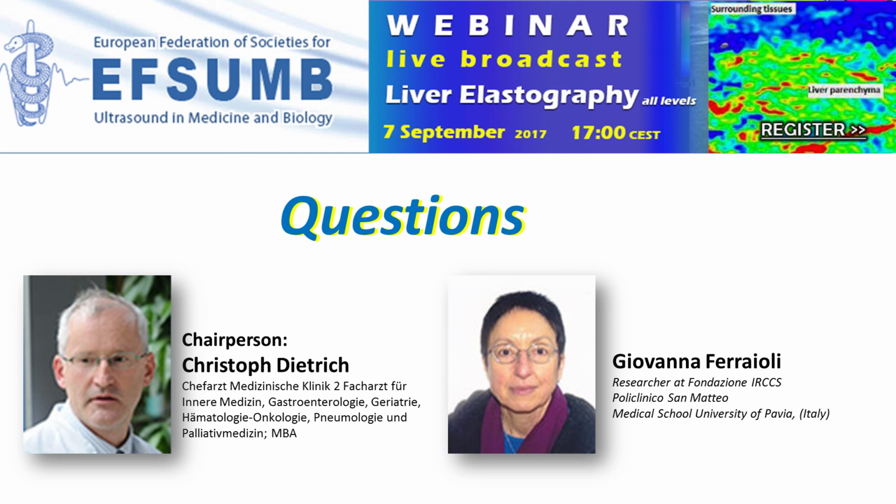The accuracy in assessing portal hypertension has been assessed comparing the results to a gold standard, that is the measurement of the pressure in the portal system. So the method is, from the literature, an accurate method. It's more difficult than liver elastography to perform. It's less reproducible, but it's an accurate method.